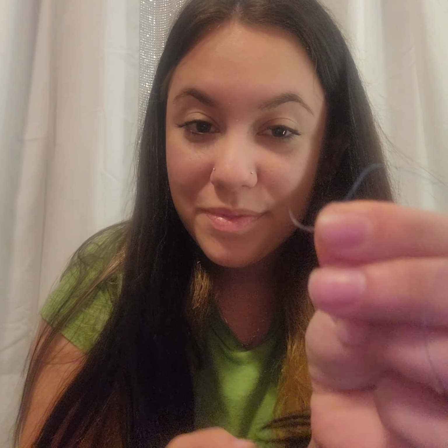Typically this needle is used for small animals like dogs and cats rather than the bigger ones you see that are normally this big, and those are used for equine and stuff. Those are the ones we normally practice with in class just because it's easier to see if we messed up on anything. And then this is the suture material itself that I will be using.